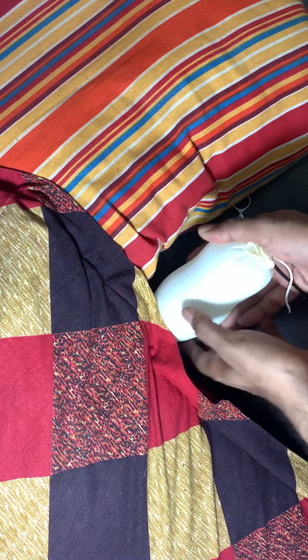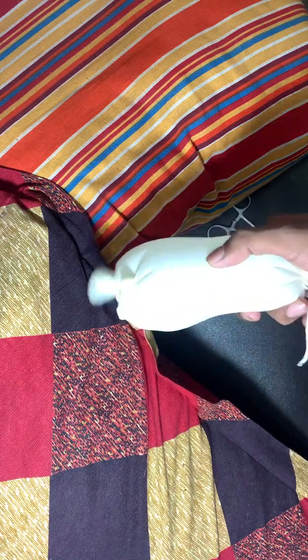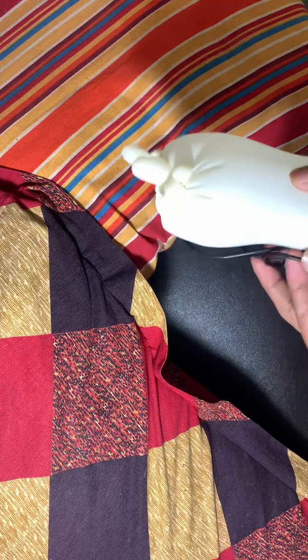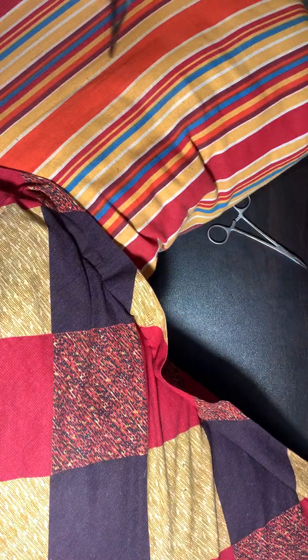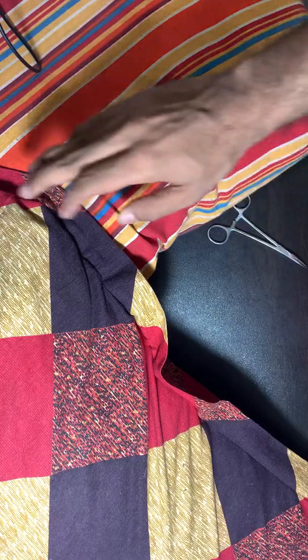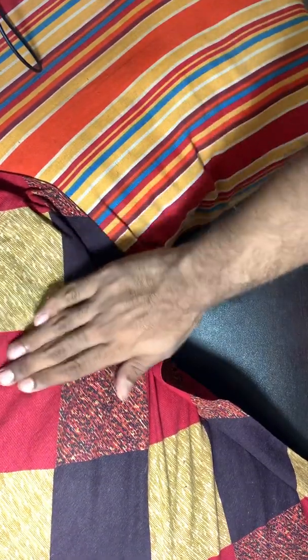Then, we need to keep the placenta in the tray for later examination. Now, give the uterine massage.